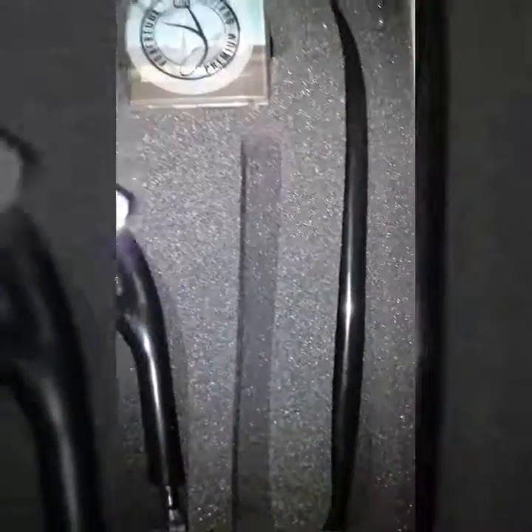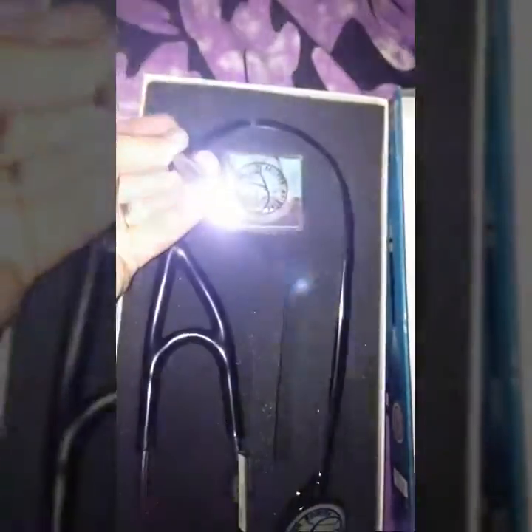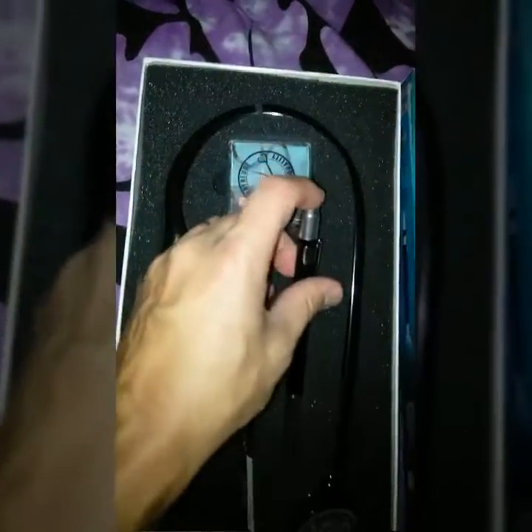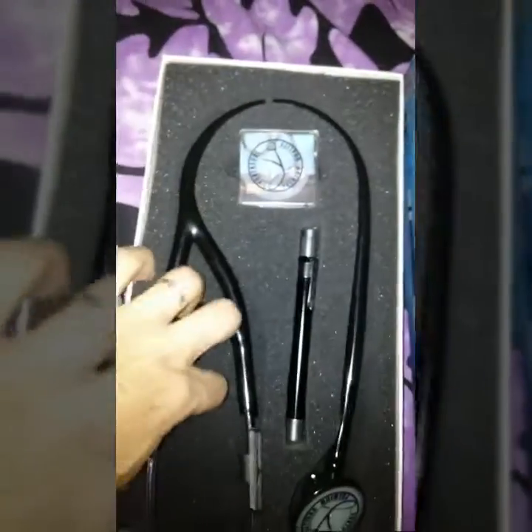It comes with a free oversized stainless steel bell and a free pupil light with batteries included. It also comes with replacement ear tips. A little bit about it: hypoallergenic, latex free, BPA free, stainless steel, and sterilized at their testing facility.